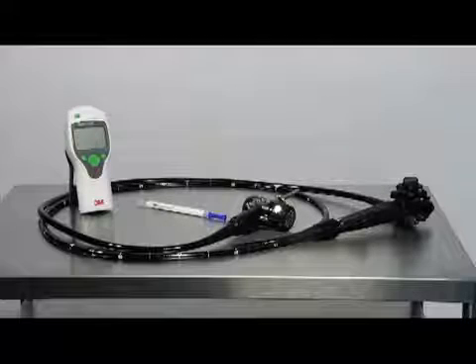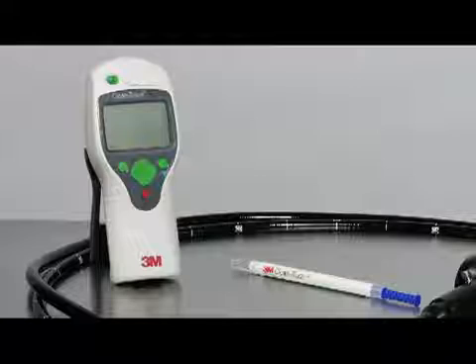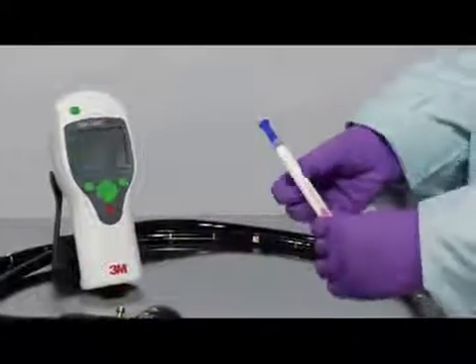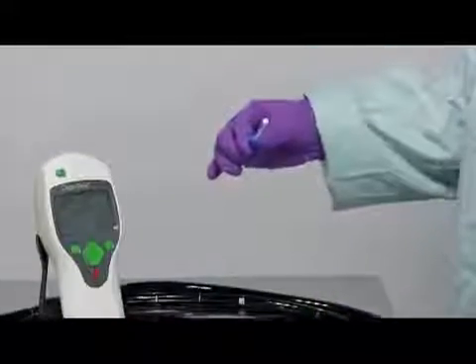Okay, this is the training video, and what we're going to be starting out with is the primary protocol. And what we're showing here are your basic supplies. Your first step that you're going to be testing is the outside of the distal end of the working end of the endoscope, which you remember is called the bending section.